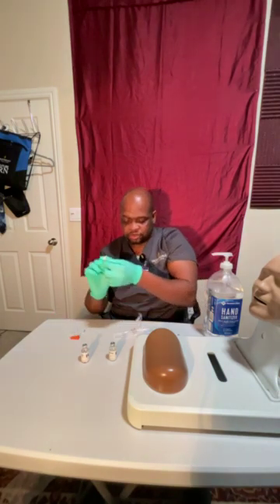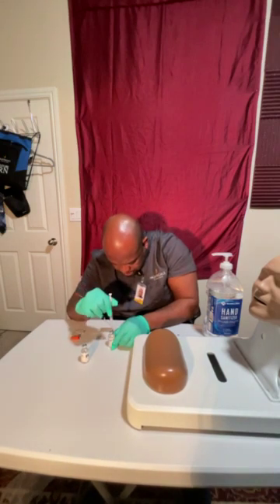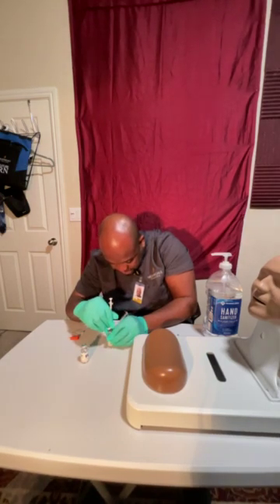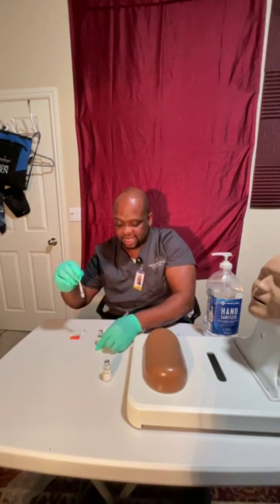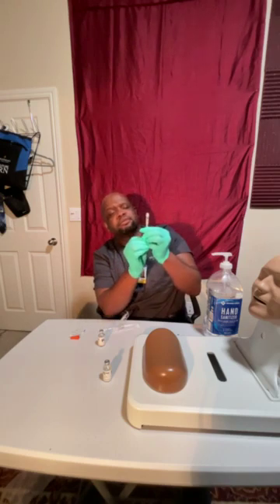8 units of air. All right, so with this 8 units, I am going to take the cap off now. And the NPH, I'm going to gently put the syringe into the medication bottle. Good. Syringe in the medication bottle. I'm going to inject the 8 units of air. Good. Now, I want to make sure I do not touch the solution. Do not want to touch the medication.